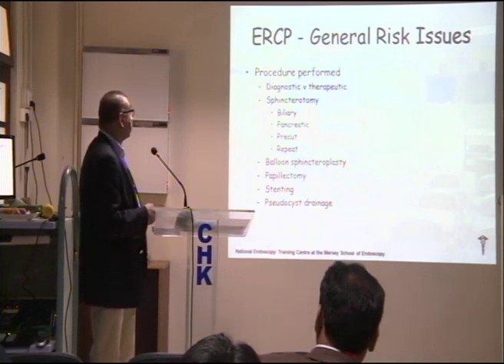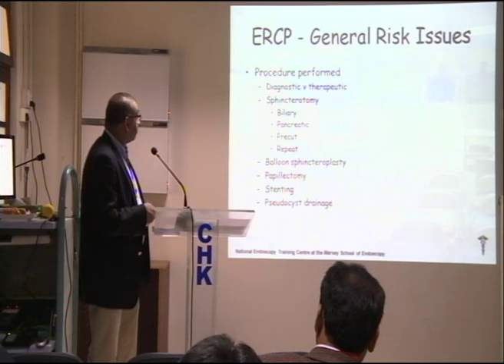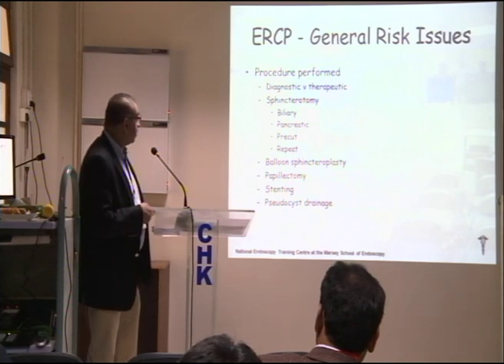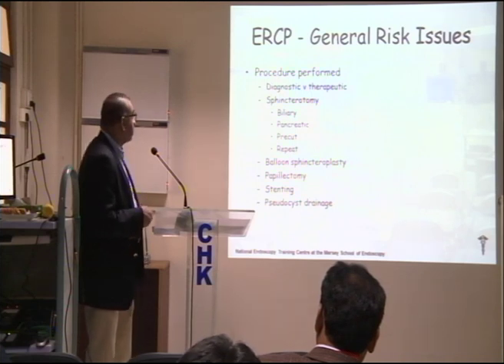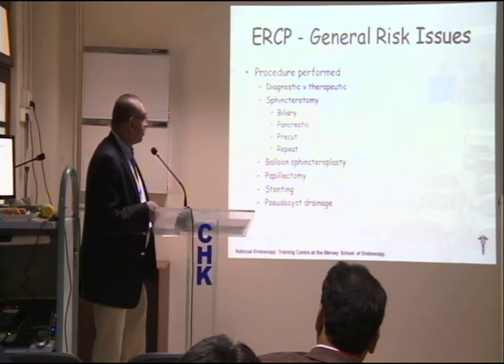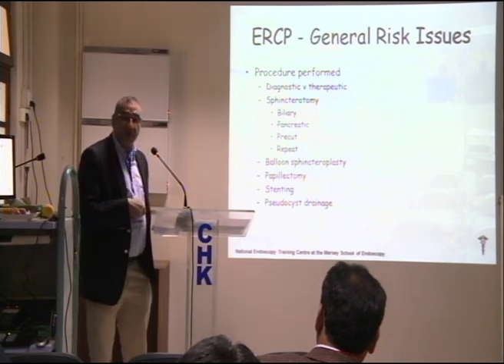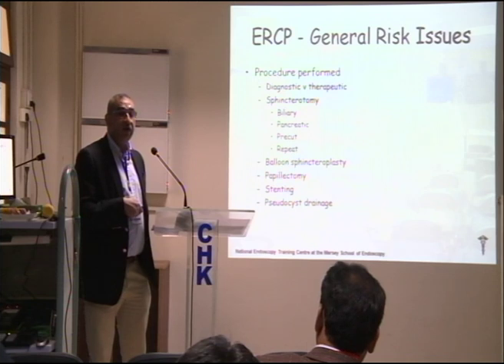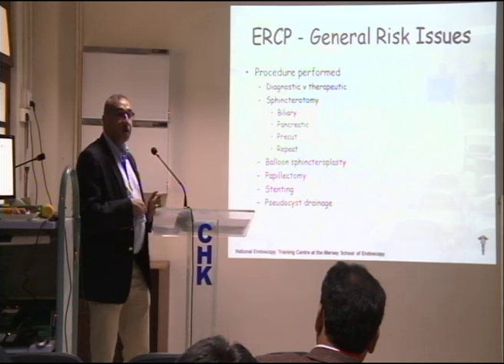If you are carrying out sphincterotomy, the complication risk is different whether you do a biliary sphincterotomy, a pancreatic duct sphincterotomy, a pre-cut, or a repeat. Pancreatic sphincterotomy carries a higher risk of bleeding and perforation if you are not careful. Pre-cut is always difficult. It is always more risk-prone, bleeding-prone, and more perforation-prone. Normally, I would not recommend that any of you even attempt pre-cuts because you do not know exactly where to place your cut.